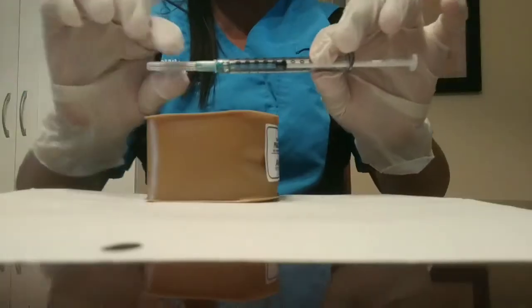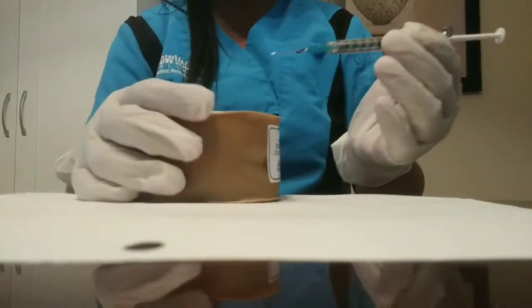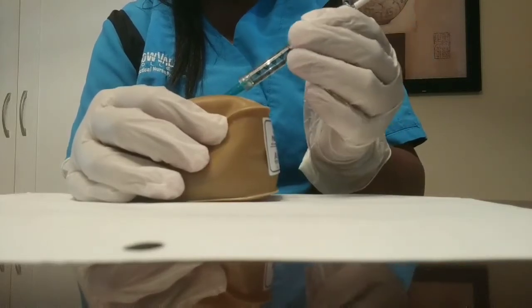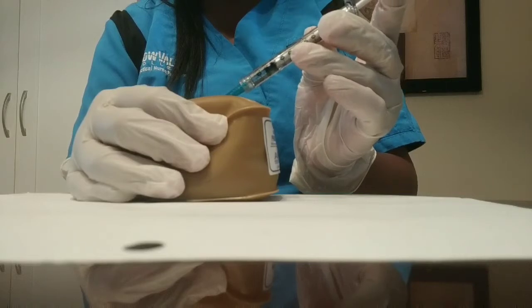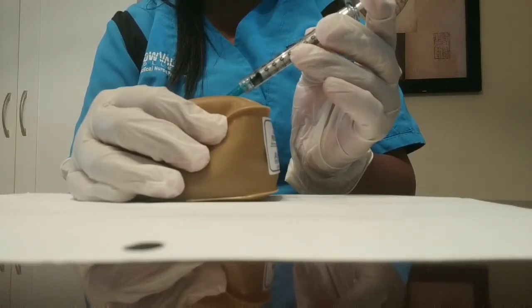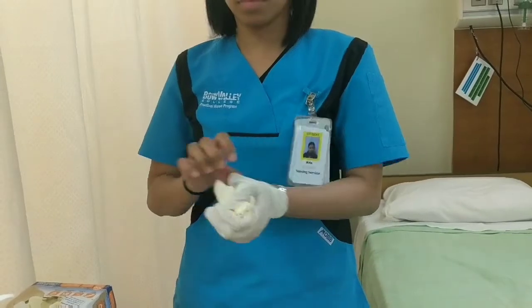If the patient has less subcutaneous fat, such as elderly, babies, and kids, you want to inject at a 45-degree angle for proper absorption in the subcutaneous tissue. And if the needle is longer, you need to inject at a 45-degree angle. Remove your gloves and do the documentation.